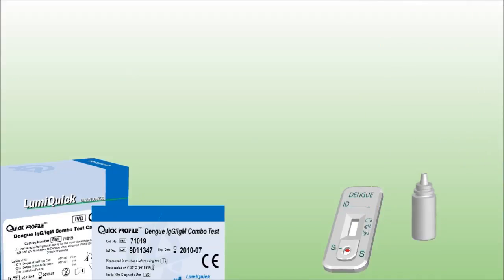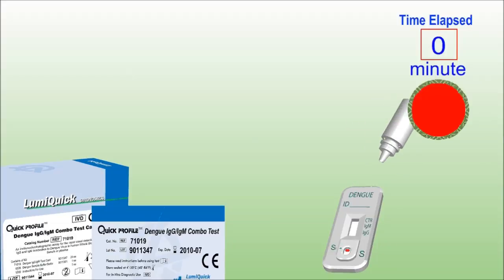Add 3 drops of sample buffer to the well. At the end of 20 minutes, read the results.